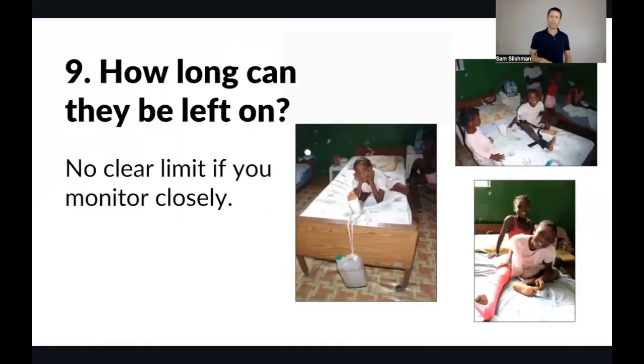I'll say this. A couple of weeks ago, I was medical director for an air show, and a woman fell, and she either broke her proximal femur or her hip. We put the splint on, and this is the first time I've done it in the field, and I was shocked by how little tug was needed to actually make her feel better. So it just does not take much force to make people feel better with traction.